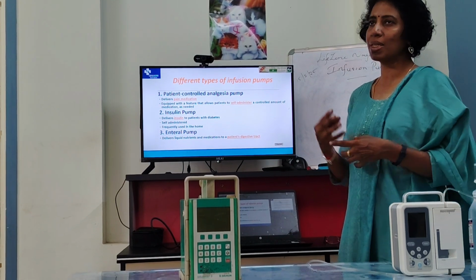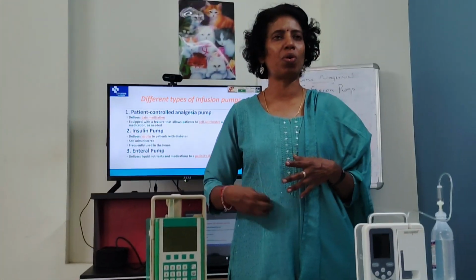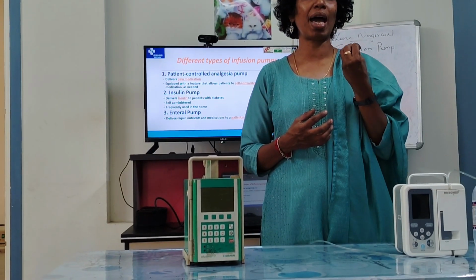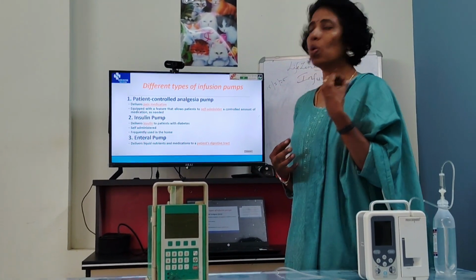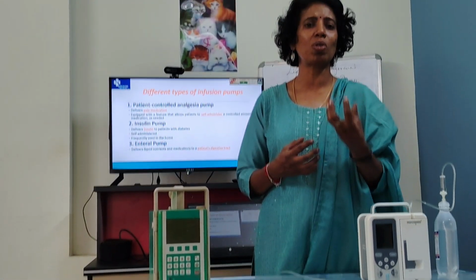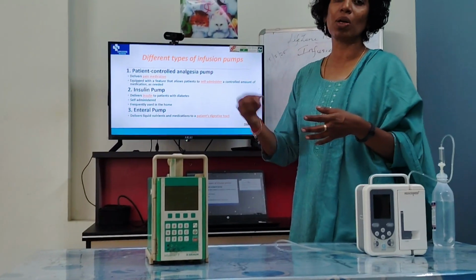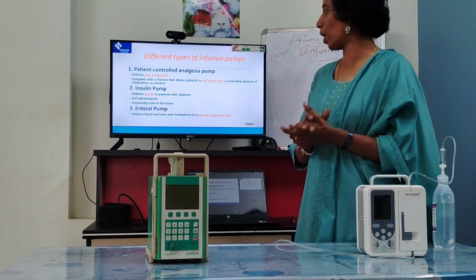And second is the insulin pump. This is a wearable device. It is worn and connected to the abdominal area. When the glucose is monitored and the glucose level increases, the insulin will be automatically administered into the body.